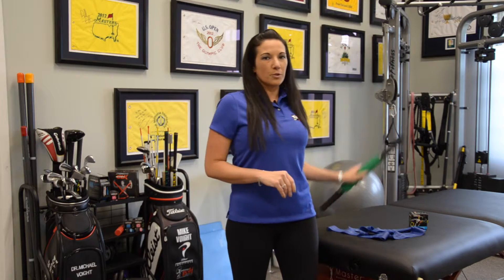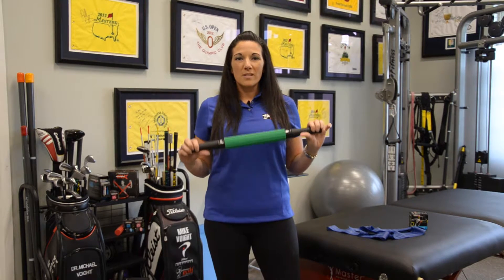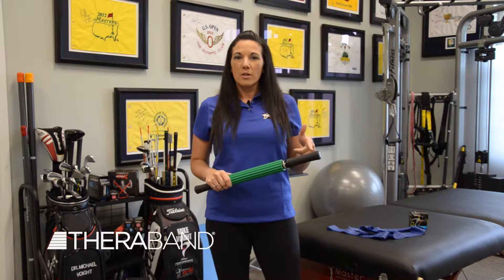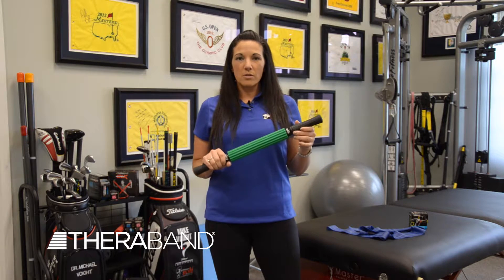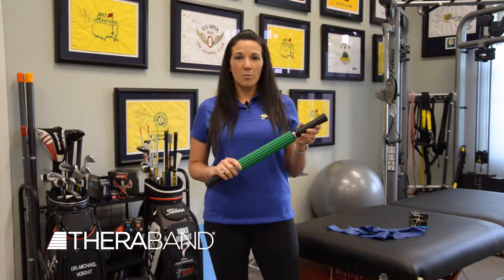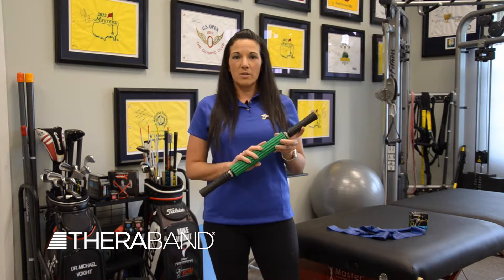Let's start with the massage roller. This is an awesome product to work on resets for mobility. We talk in the SFMA about reset, reinforce, and reload. This is a great tool for resets. You can instruct your patients on how to work on mobility at home. There are lots of great exercises that we use all over the body using the massage roller.